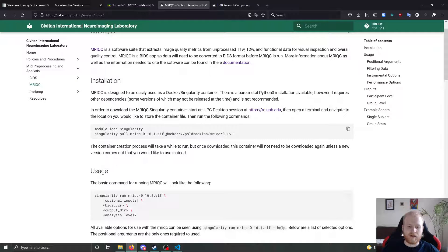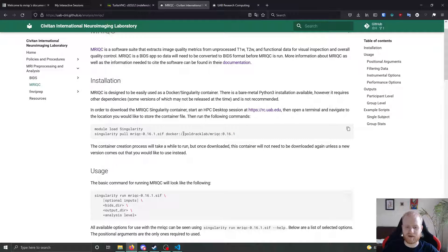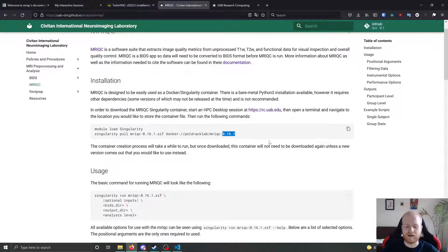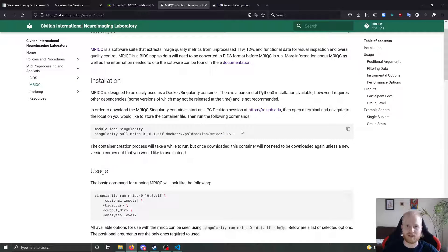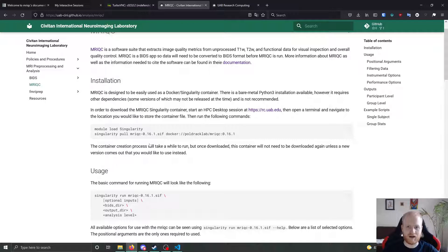And then you're going to give it the path to the Docker image. In our case, it's going to be Docker colon slash slash Poldrack lab slash MRI QC colon, and then zero dot 16 dot one, which is the version number. This is the most recently stable version that I've gotten to run consistently.